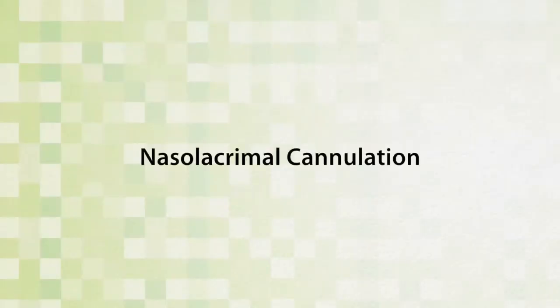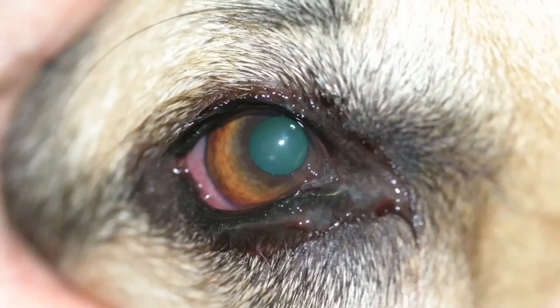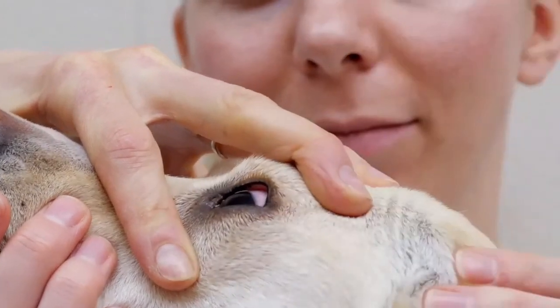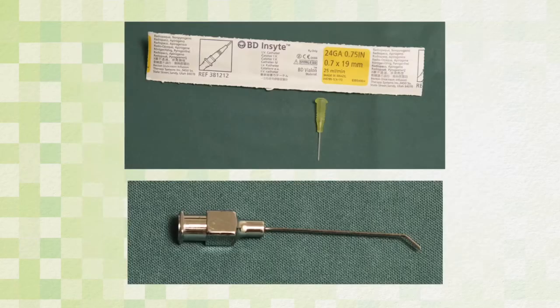Nasolacrimal cannulation and flushing. In patients with chronic epiphora or mucopurulent ocular discharge and a delayed or negative Jones test, nasolacrimal cannulation and flushing should be performed to rule out disease of the nasolacrimal system. In most dogs, this procedure can be readily performed under topical anesthesia with or without head loops to magnify the puncta. To perform the procedure in small animals, a 22 to 24 gauge soft-tipped intravenous catheter or a lacrimal cannula is attached to a 3 ml syringe filled with saline.